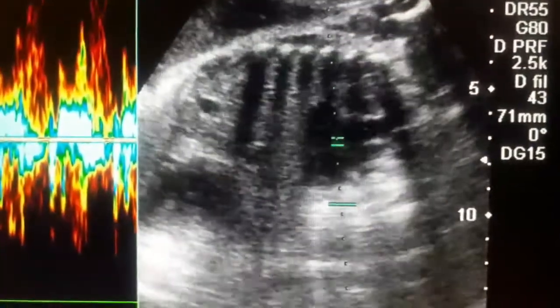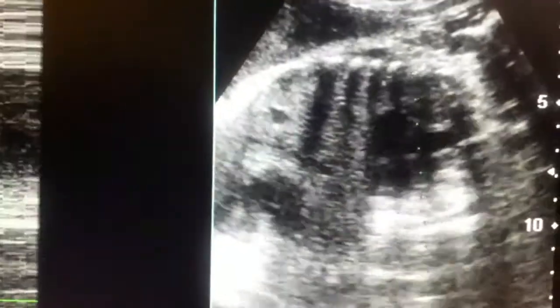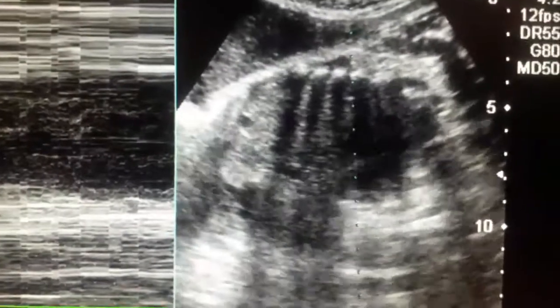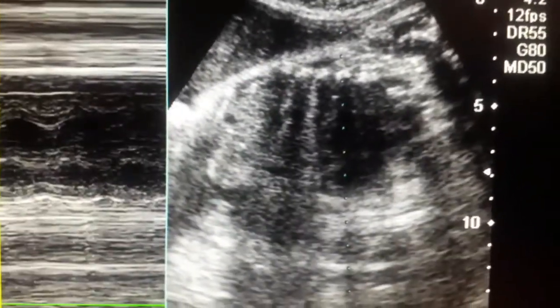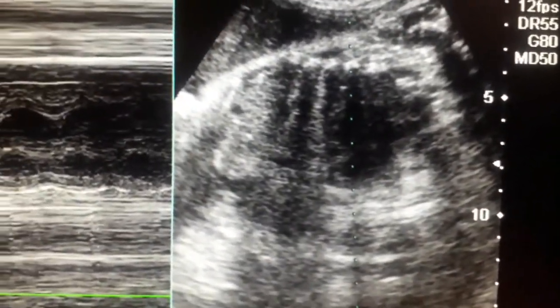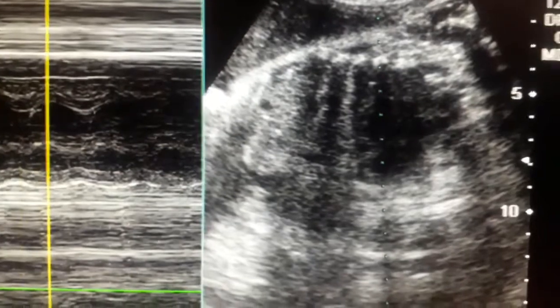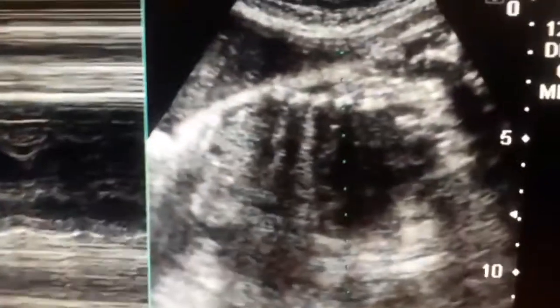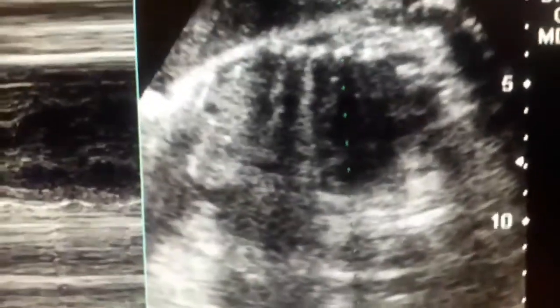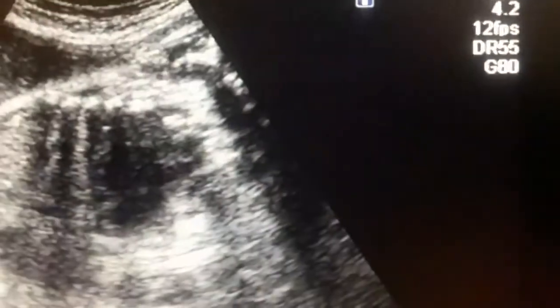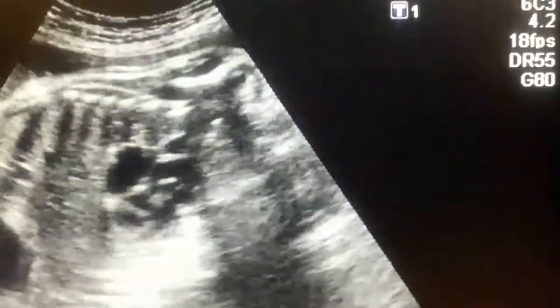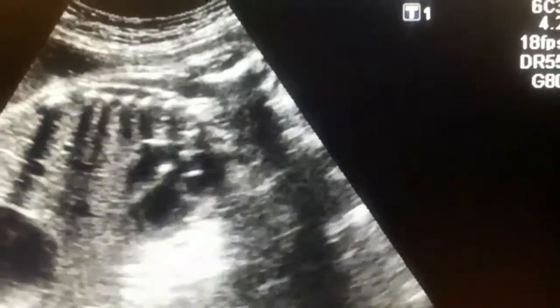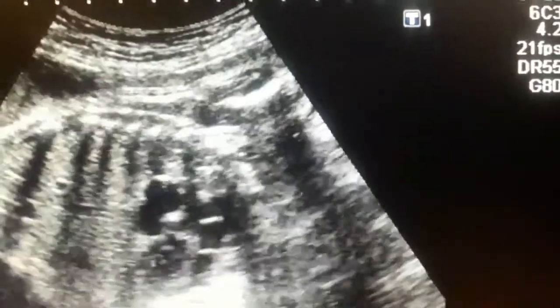Now I am calculating the heart rate with the help of the waveform. You can see it is above 125 beats per minute. Normally it should be 120 to 160.